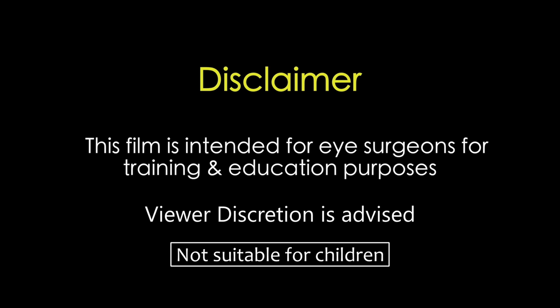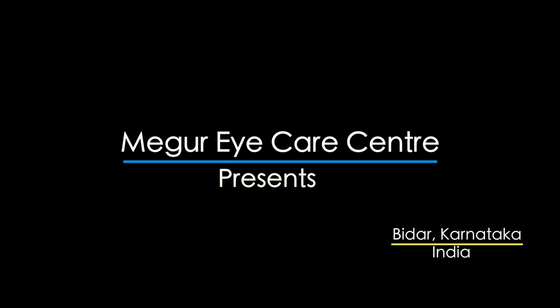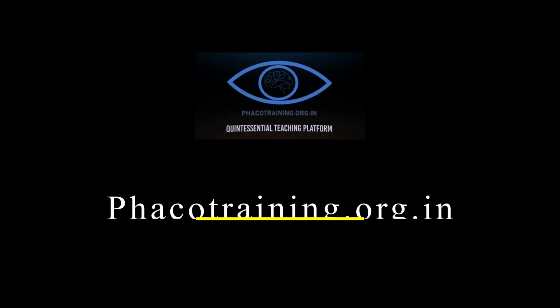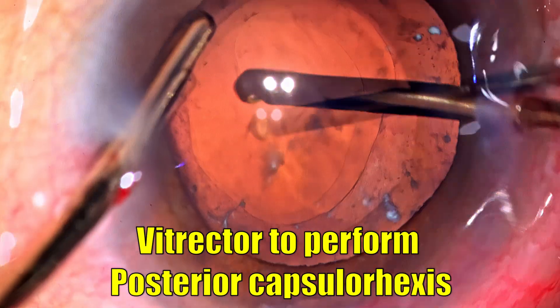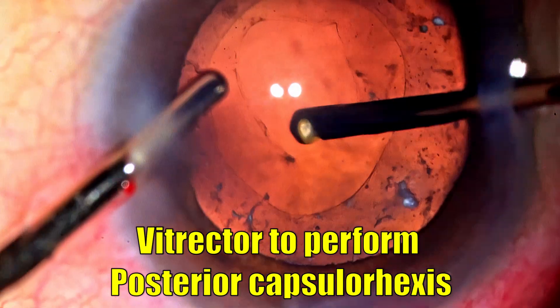This film is intended for eye surgeons for training and education purposes. Viewer discretion is strongly recommended. We will be using a vitrector to perform a posterior capsulorrhexis in a compromised eye — let's find out how it is done.